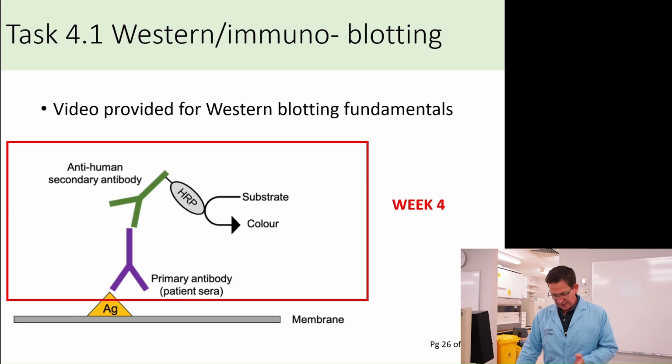In this week, we're going to start using our antibody solutions, the primary antibody, or the patient's sera, which hopefully will seek out and bind to one of their antigens of interest in a specific fashion. We can't see that, however. There's no way to visualize that primary antibody in the format that it is. So we will then come on with a secondary antibody. And our secondary antibody has an enzyme which will be familiar to you, known as HRP, or horseradish peroxidase. It's the same enzyme that we used in the RPA naked eye detection that you remember from the first week.